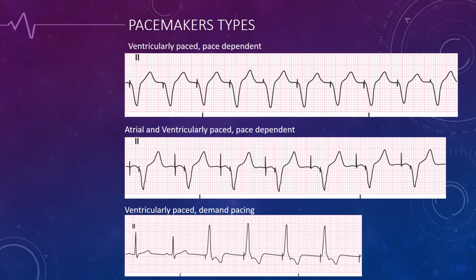Here's how you identify pacemakers. See the spike right there? Those spikes are not real. Okay, well, actually that spike is, but this spike is not real. The computer put it in there. The computer is looking for electrical signals that are of a duration and an amplitude that are likely to be from a pacemaker. And if it sees one, it's just going to make a big slash for you so that you can identify it.